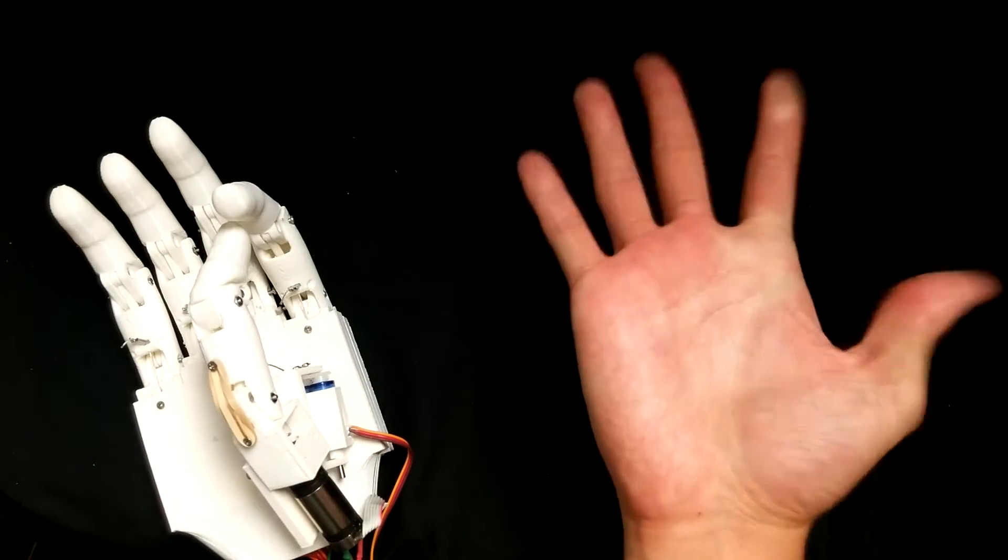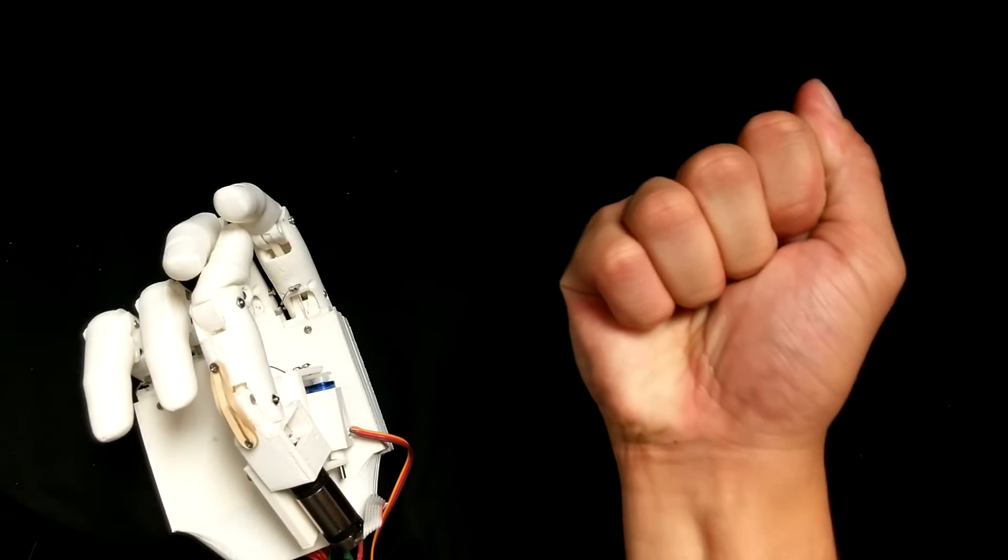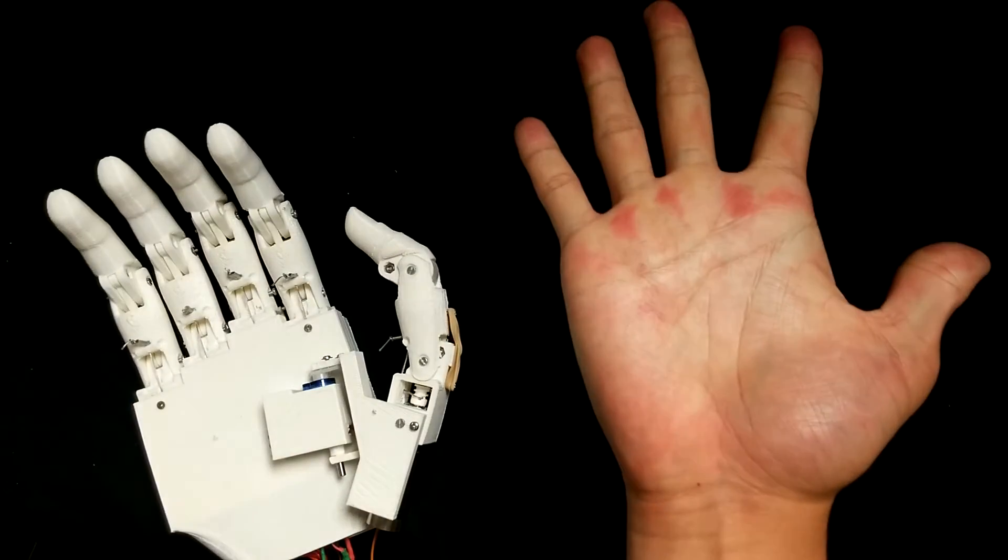Users of the prosthesis can achieve different grips with myoelectric signals coming from their limb. The TACT is successfully able to grasp a number of household objects with these grips.